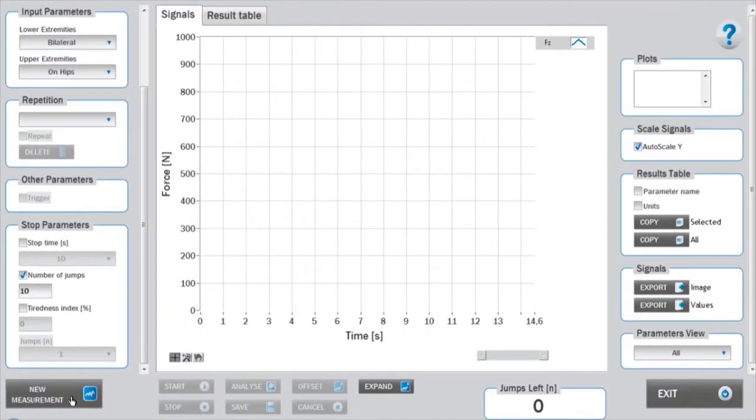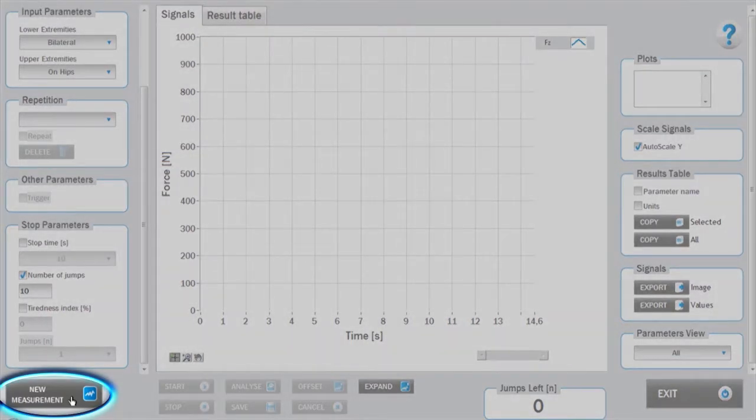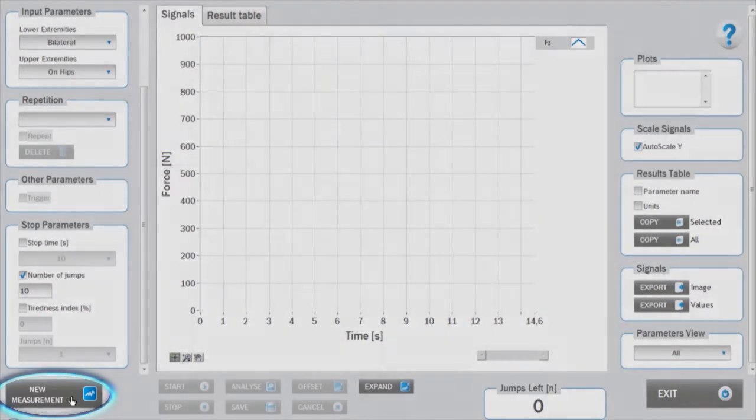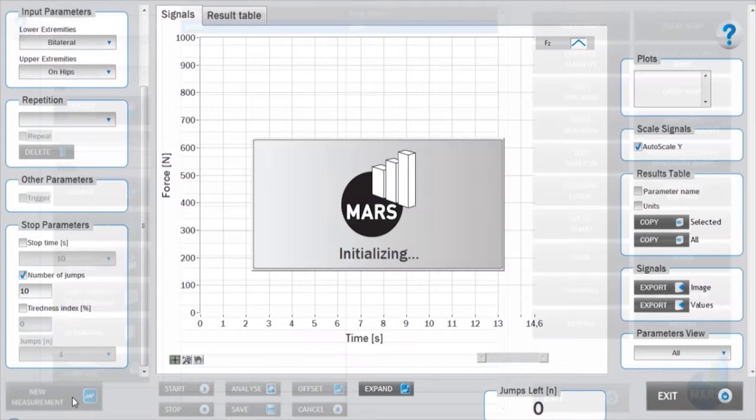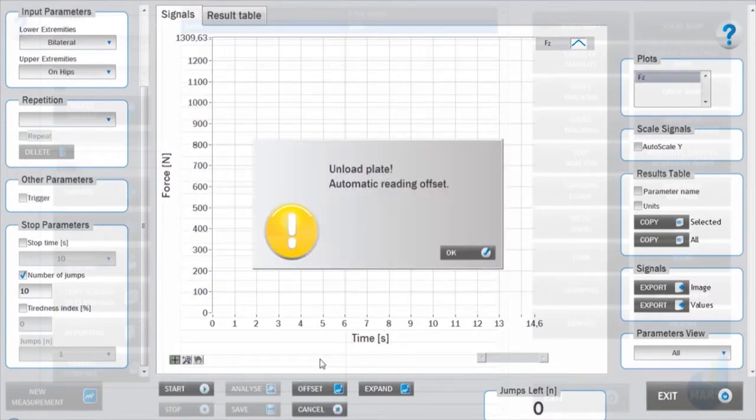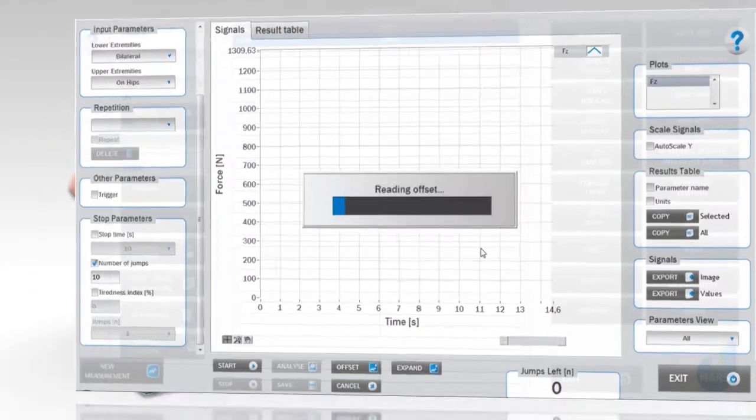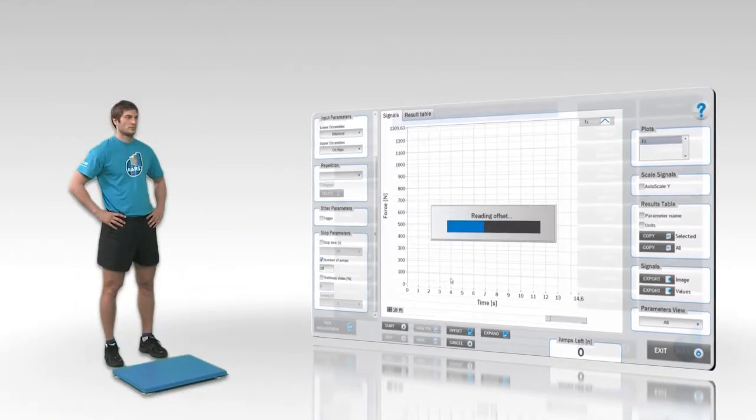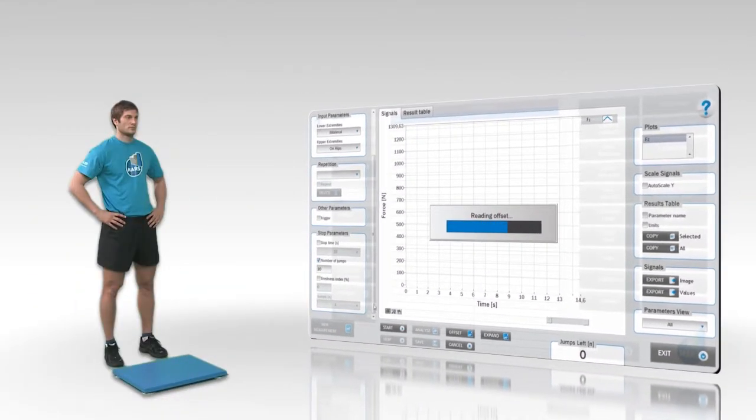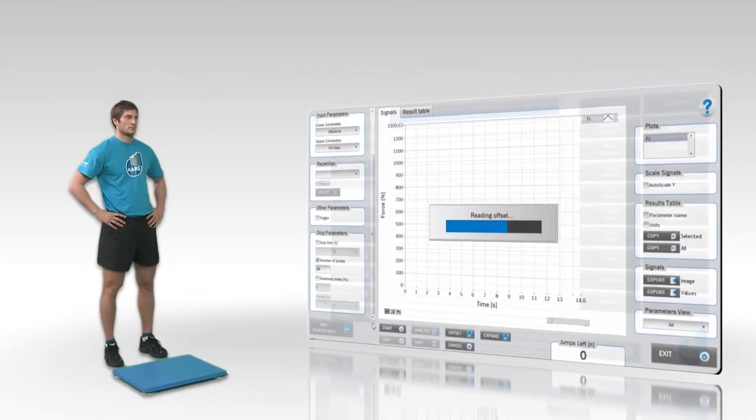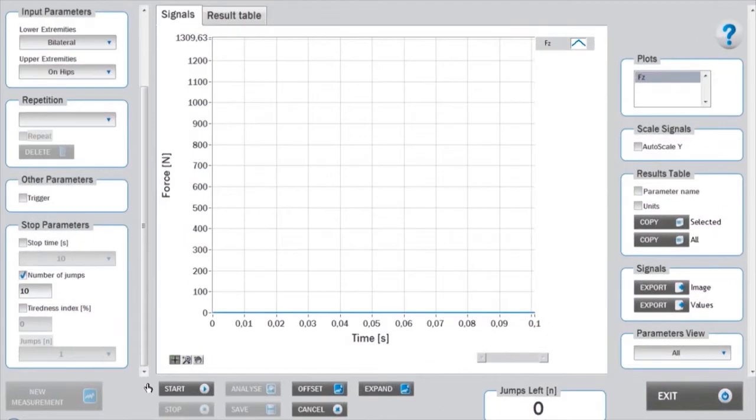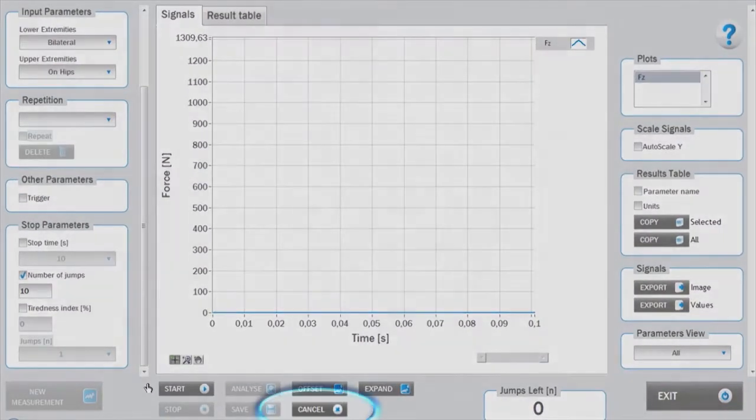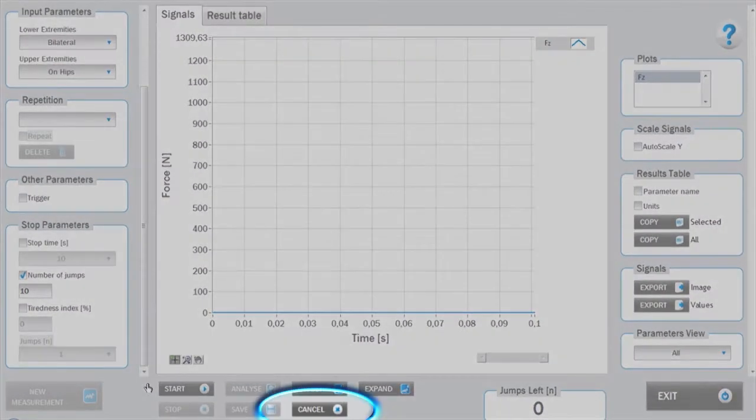To start the measurement, click on the new measurement button. After launching the test module and clicking the new measurement button, initialization and offset takes place. During this time, the subject should not be on the force plate. If necessary, the measurement mode can be cancelled by pressing the cancel button.